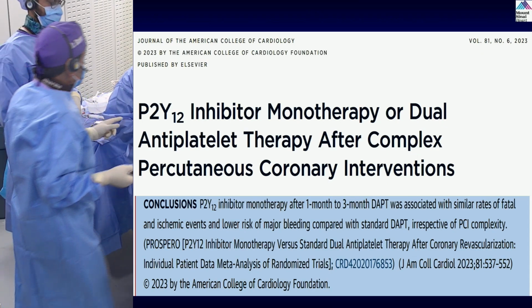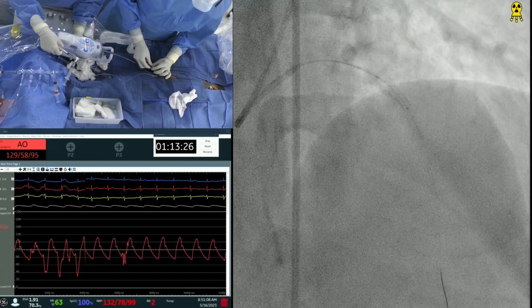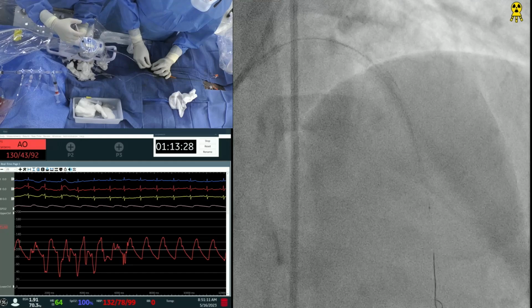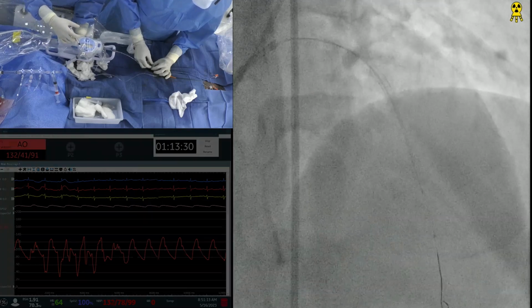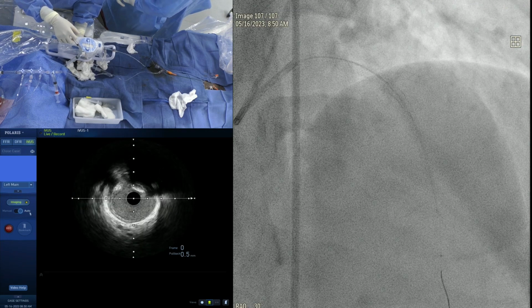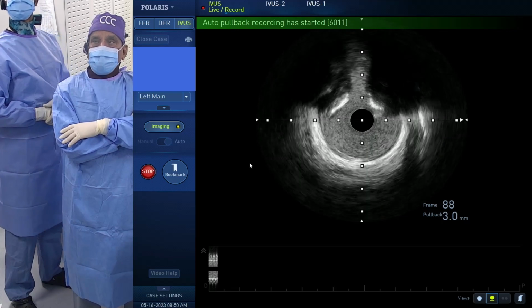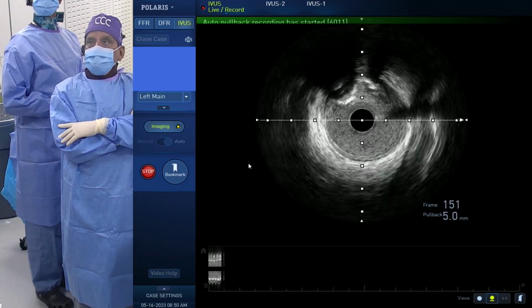You are ready for IVUS? Long time. You're doing it or you're done? Done once, repeating again. Okay, let's go back to IVUS. I think this is important because I'm sure everybody wants to see the live IVUS. Full screen, yeah. Okay, start to work. Yes, IVUS on the main screen, it's coming. Please. Yeah, it's this LAD native. Yeah, it's coming back.